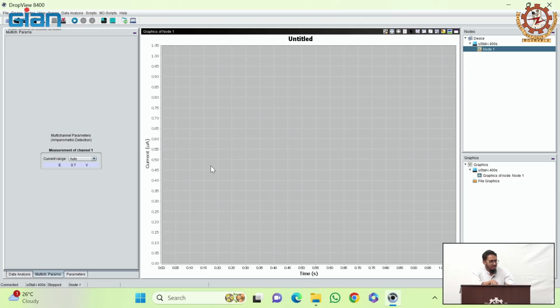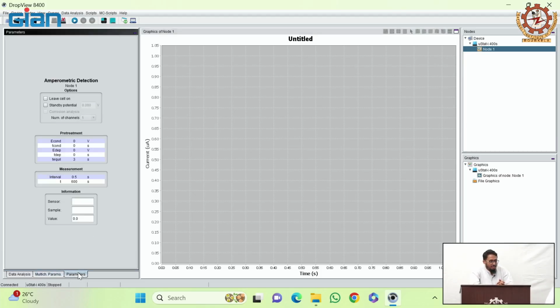Ready? So now we are proceeding with the stabilization. You can show the screen. So here we will do an amperometry step. So amperometry, as you can see on the screen, it says amperometric detection. We have to set the oxidation potential. Please.